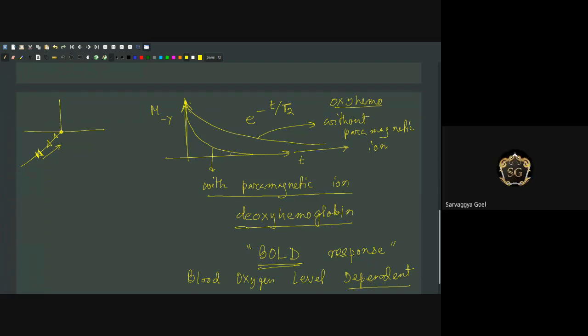So it's not with the theory, but when we see the MRI, which part is dark and which part is whitish? Oh, okay. You mean that if you look at the raw signal, then any part where there is no proton will show up as the dark area. Any part where you have a lot of protons will show up as a bright area. I'm talking about the raw signal.